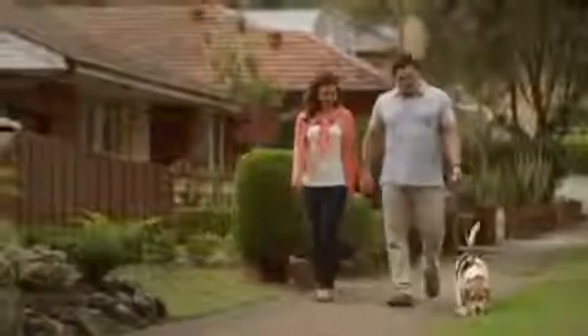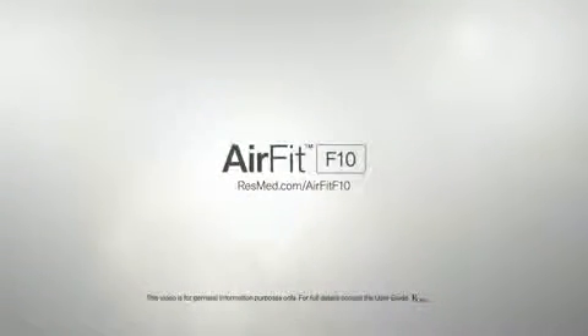Life starts with a mask that helps give you the sleep you'd like, so you can enjoy every day and appreciate the simple things in life that are often the most rewarding. The AirFit F10 is part of ResMed's AirFit range — the right fit for you.